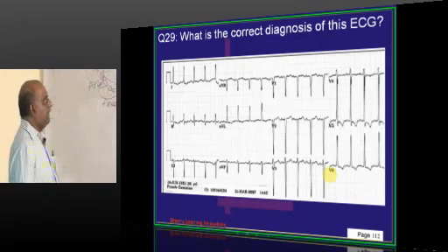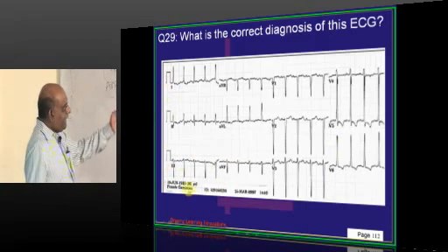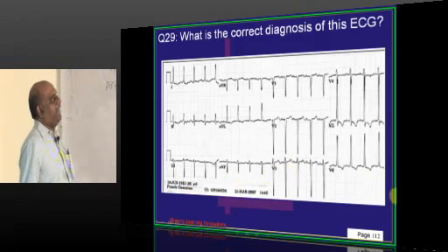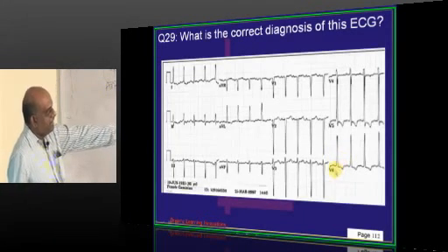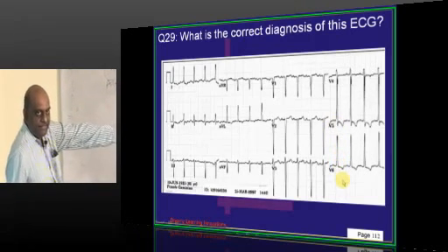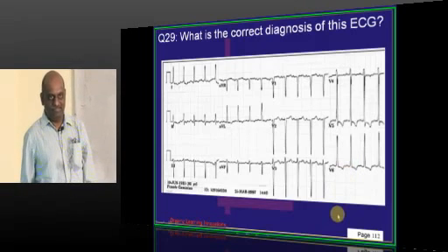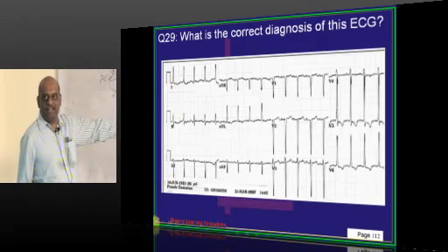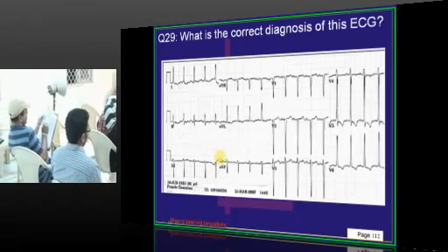Now what is the correct diagnosis in this given case? What is the type of axis बोलो? 1 ऊपर देख रहे, 3 नीचे देख रहे, इसलिए क्या हो गया वो? Left axis deviation है. और how is the V6 में R is very prominent and T wave got inverted. That's the reason left ventricular hypertrophy and inversion of T wave is called strain pattern, which is supported by your left axis deviation. To call it as LV hypertrophy is what need to be remembered.